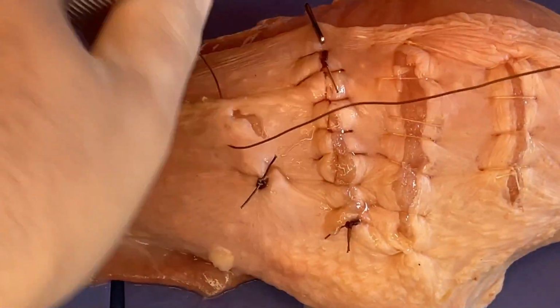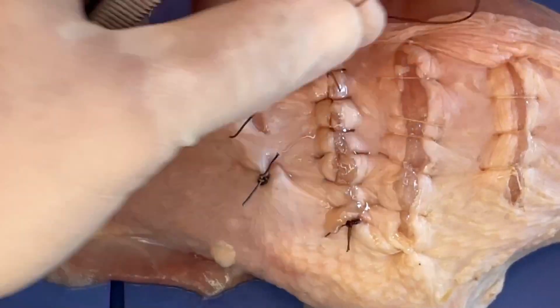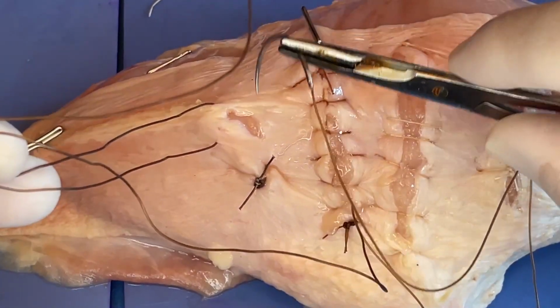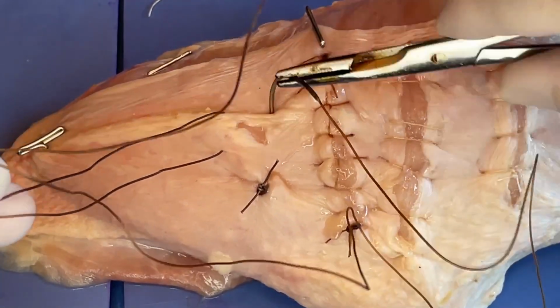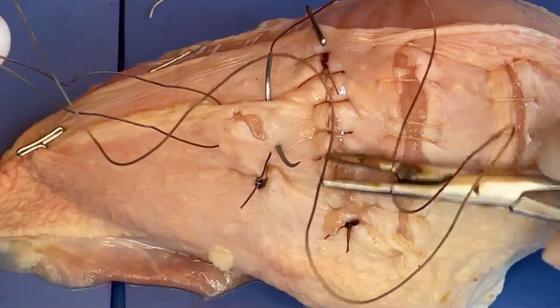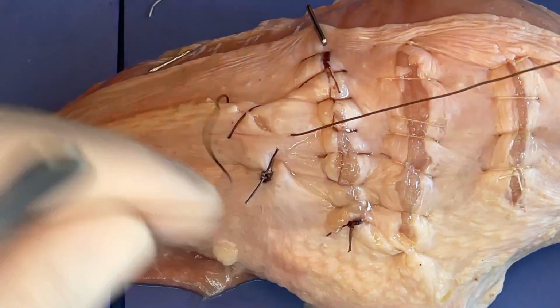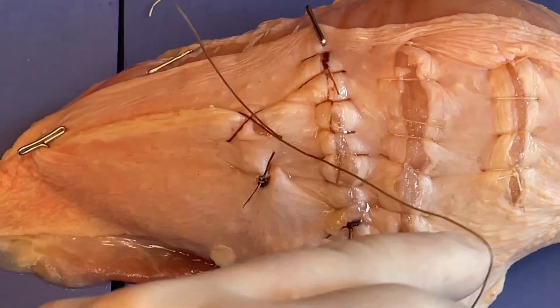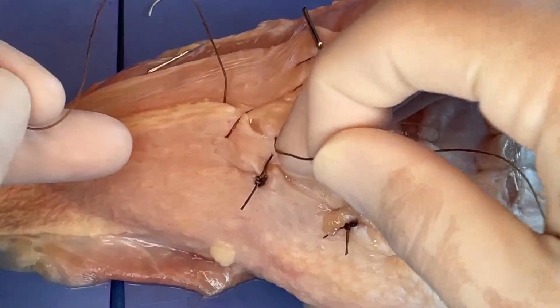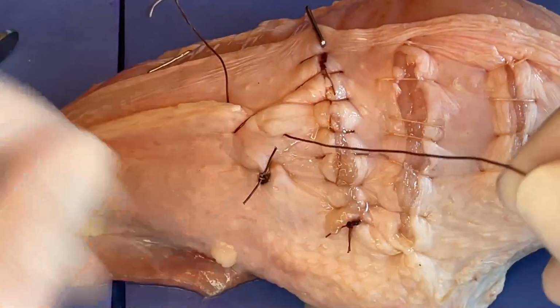And then for our second throw, some people like to kind of grab onto these 2 and kind of pull them up. That's perfectly fine if you like that. And then for our second, we'll come here, like that, and pull that through. And again, we're creating this kind of X shape to close over that. Just pull that through so our tail's not quite so long.